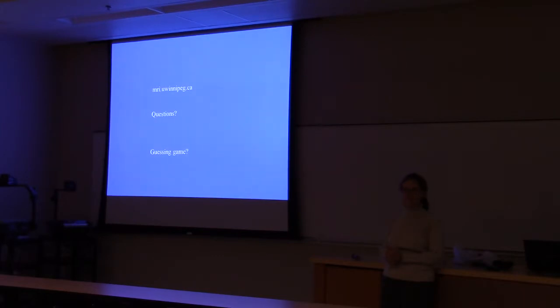I've heard of something called diffusion tensor imaging. That's different than this, right? It's somewhat different. So this, we're just going to put it on in one direction for now, across the axons, so we'll be able to get the axon diameters. But if you want the diameters and the lengths and so forth, then you need the other directions. So what happens with diffusion tensor is you put it on in multiple directions, and then you can see which way everything's going. And if you're around tomorrow morning, I'm going to show you some of our applications of diffusion tensor.